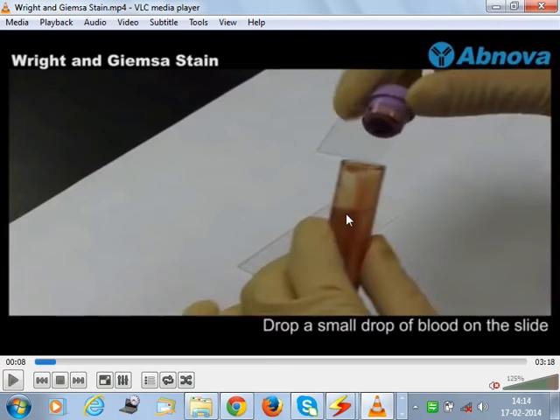You would like to know your own differential count, isn't it? Yes or no? Yes. That's better.